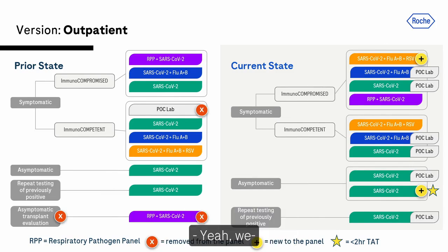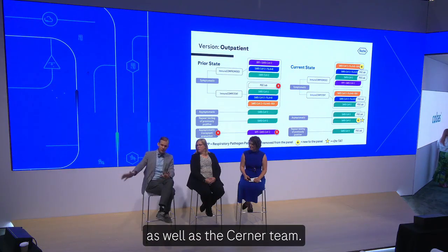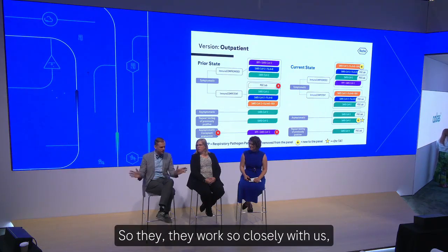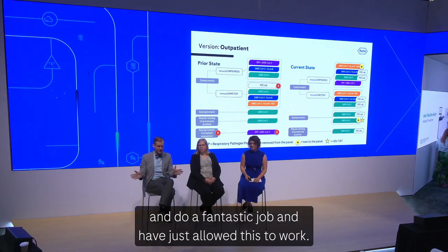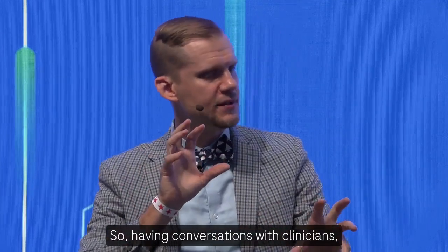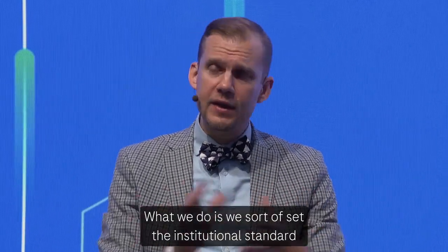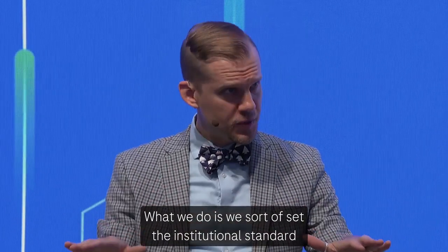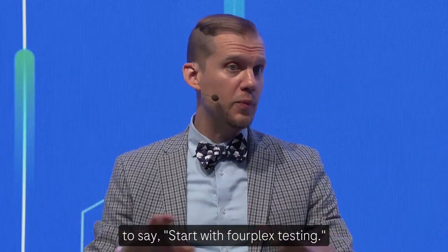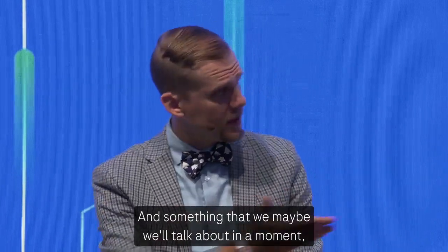Yeah, I just want to give also a shout out to the teams at Vanderbilt, the Epic team as well as the Cerner team. They work so closely with us and do a fantastic job and have just allowed this to work. So having conversations with clinicians, designing how that needs to look for Epic. What we do is we set the institutional standard to say, start with 4-plex testing. So SARS-CoV-2, flu A, flu B, RSV. That's really where we think most people should start.